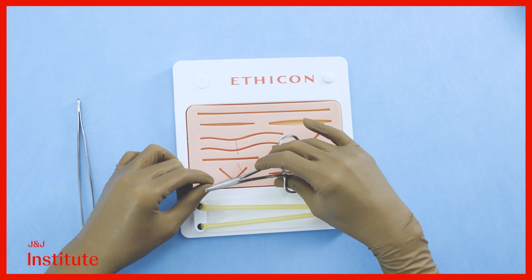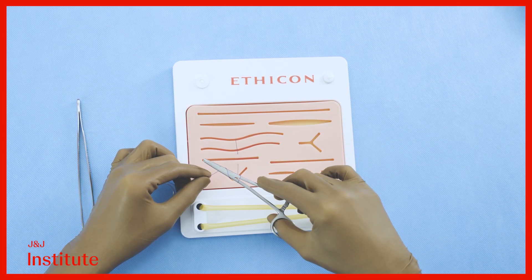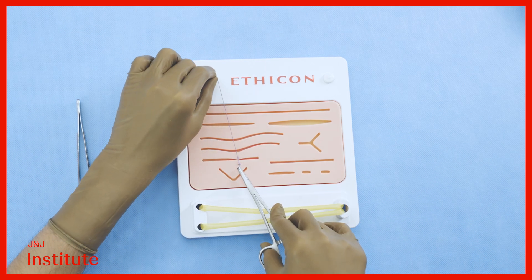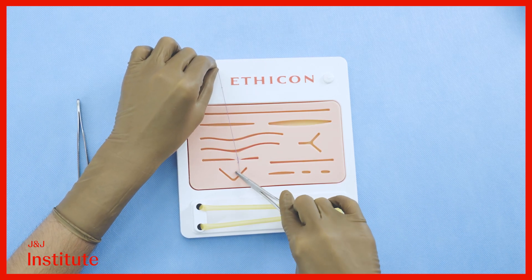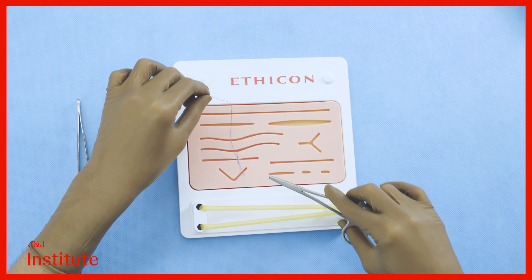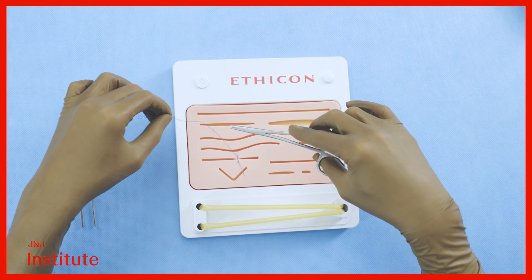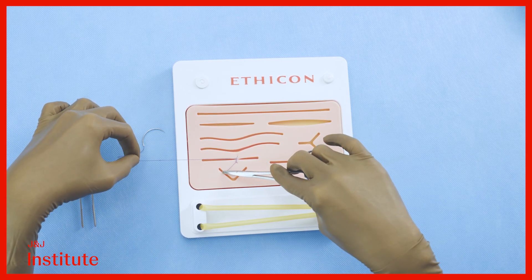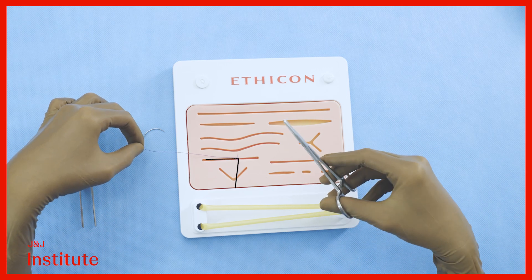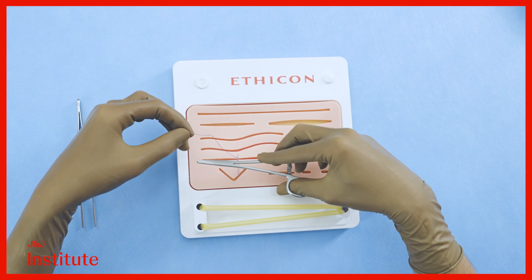We'll be starting with the surgeon's knot. This is done by creating two loops of the suture around the needle driver, grabbing the short end, and pulling it through while crossing the hands. This lays the half hitches flat against the tissues. Because we have crossed our hands, we now have a reversed V with the short end lying towards us.